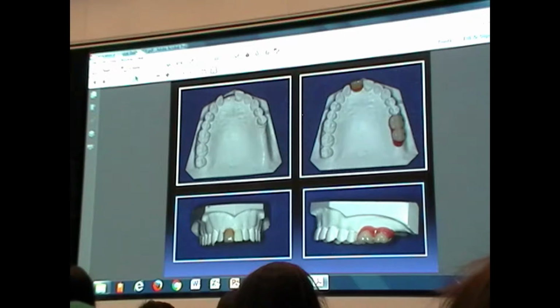If you slack on this, then the surgeon is starting off without enough information and will just put the implant wherever he or she decides to place it. That then makes it more challenging for you to restore. Not only challenging, it can become very expensive.